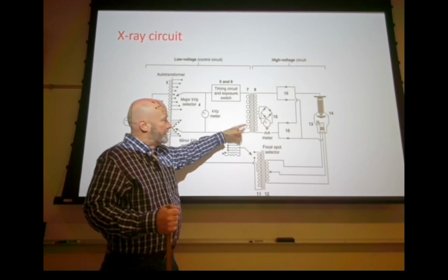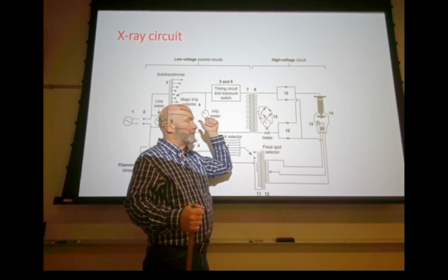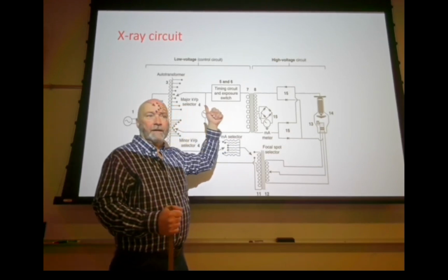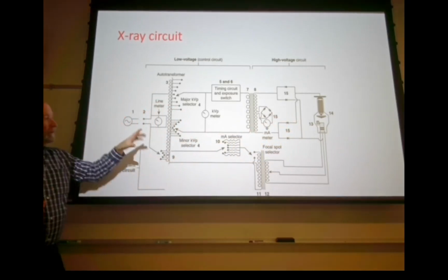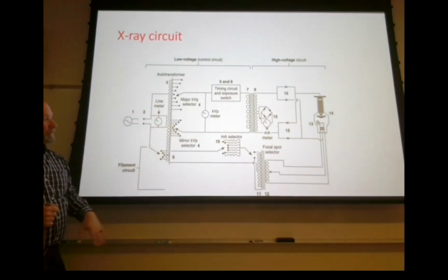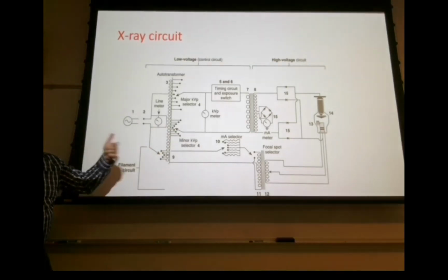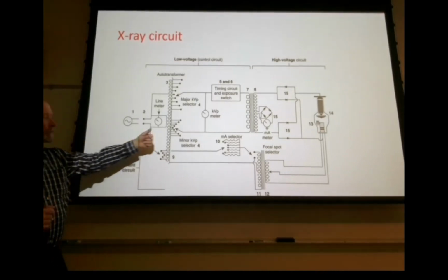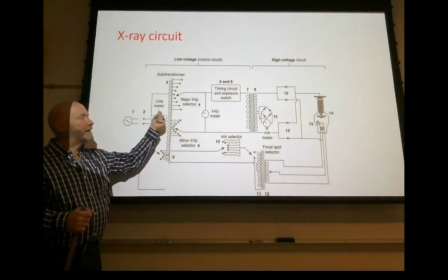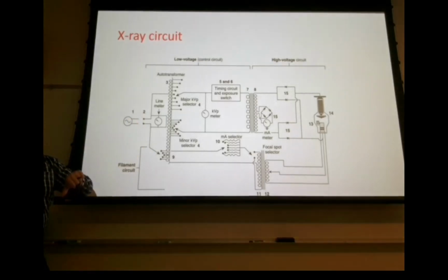And notice on this coil, we have more turns on the secondary side than on the primary side, right? That means voltage is going to go up, all right? So back over here to the auto transformer, we only have one coil of wire. We feed it alternating current, it sets up a changing magnetic field, and if we tap into the secondary side of the auto transformer, then we can either increase or decrease our voltage, okay?